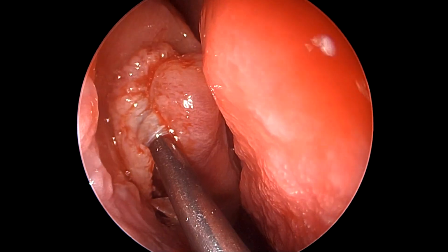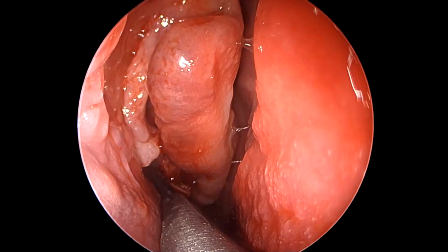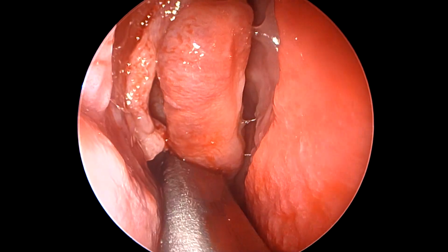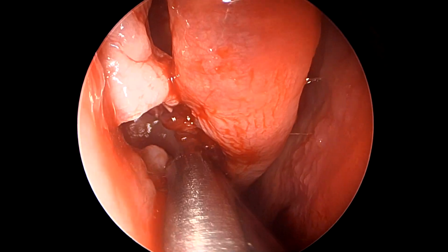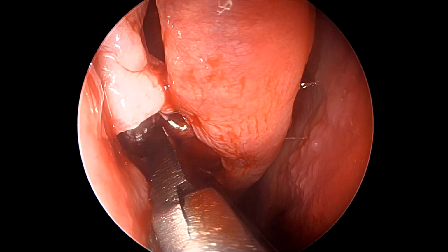Now, it's very important to understand that since the frontal sinus is the key area to be opened in this surgery, the uncinate process has to be removed all the way up, and no remnant of it can be left. Otherwise, the frontal sinus recess would be very difficult to open. So we can use a straight through-cutting forceps to increase the maxillary sinus antrostomy.